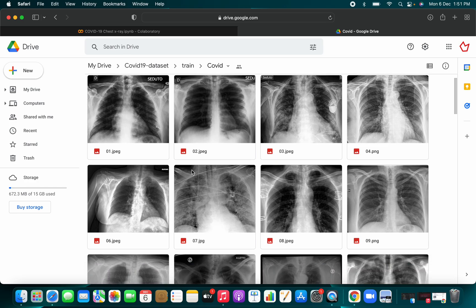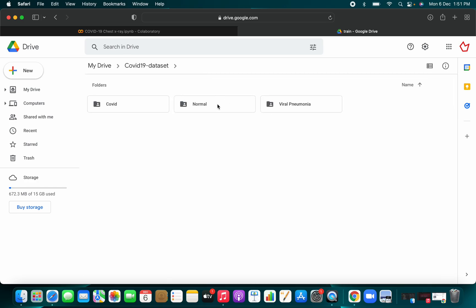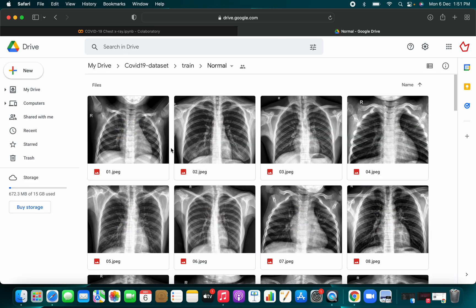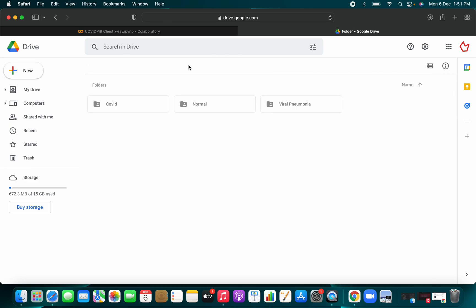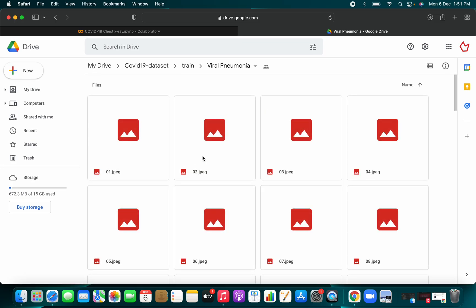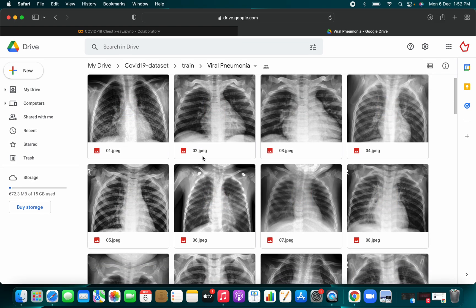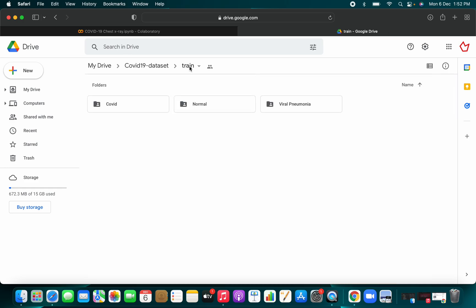In the training folder, you will have three classes: COVID, normal, and viral. The COVID folder contains all images related to COVID. The normal class is for patients not suffering from COVID or any viral disease — that is their chest X-ray. The third class is viral — you can call it pneumonia. So you have three total classes and you want to build a model that can classify between COVID, normal, and viral.